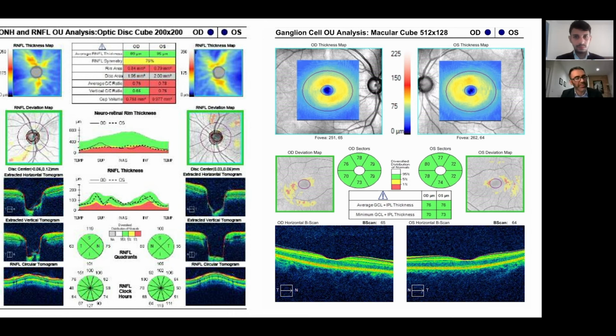Quite possibly. This area over here on the left-hand side, that might have gotten worse, but I don't think it changed much. I think it might have changed just a little bit. But again, we don't look at things in isolation, right? So as I always mention, you want to compare and contrast.